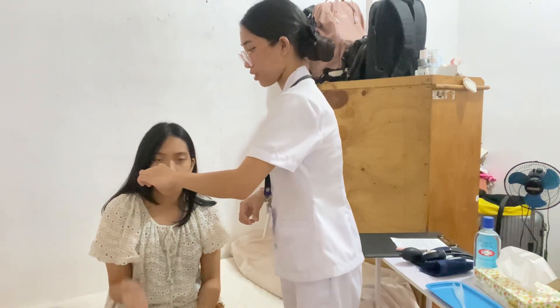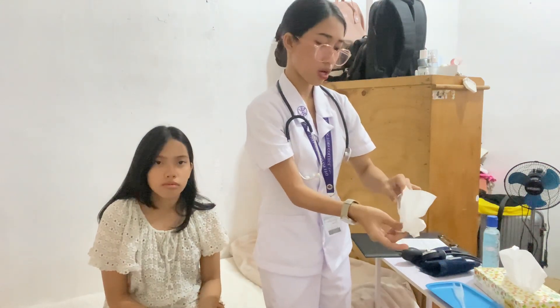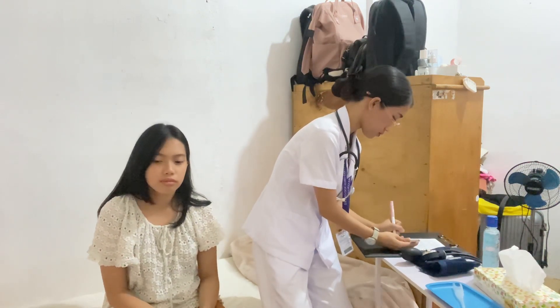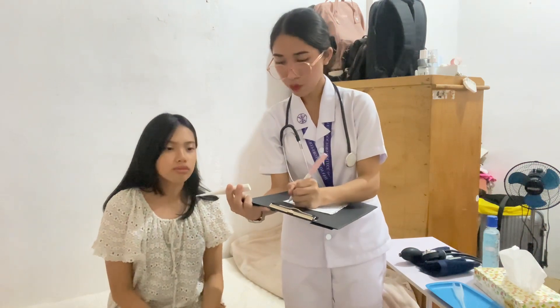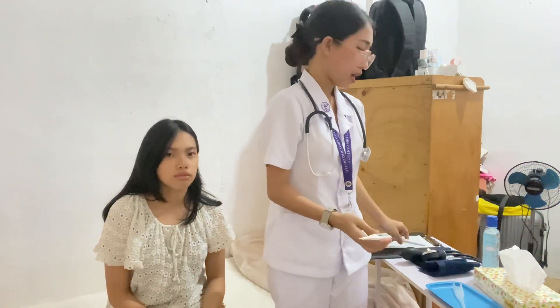Okay, thank you ma'am. Open your mouth. Thank you. Clean the thermometer from stem to sensor and discard the paper. Now record the oral temperature. Your oral temperature is 36.6 degrees Celsius. This means that your oral temperature is within normal. We have to remember that the normal oral temperature ranges from 36.1 degrees Celsius to 37.2 degrees Celsius. Now put the digital thermometer on a clean and dry surface.